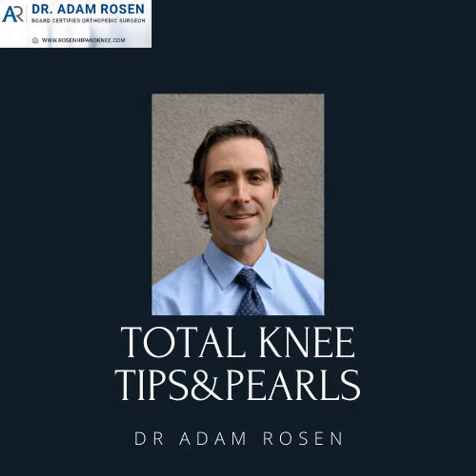And you can really angle from the anterior medial across the front of the tibia, but you need to be aware of your patellar tendon. This is where small, very narrow osteotomes are useful, because if you have a wide one, it may stick out and you could damage the tendon. And then you want to get posterior. Most tibial base plates will have a cutout. So the question also then is, can you get in there and use the osteotome to get especially that posterior lateral corner? That's the area where it's really difficult. And I find a lot of times people will leave bone attached to the implant. So if you can get around the posterior medial aspect of the tibia, sometimes with a long enough blade, you can go across that area and get over to the lateral side.